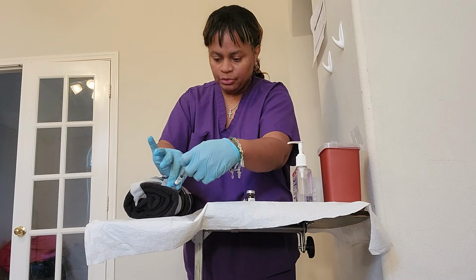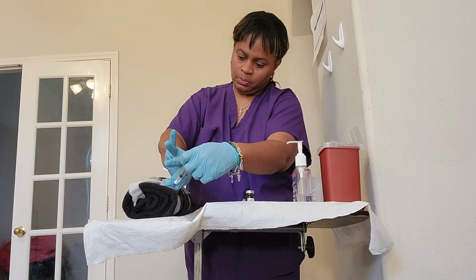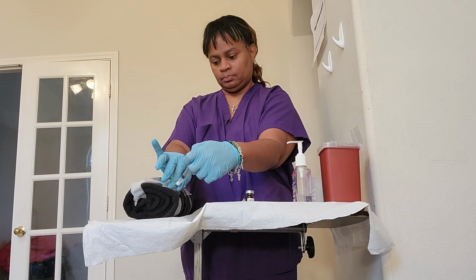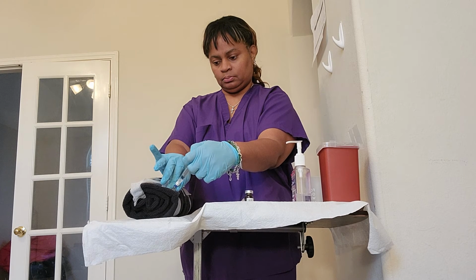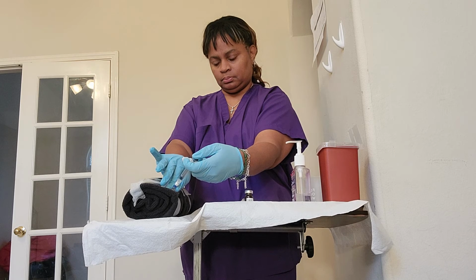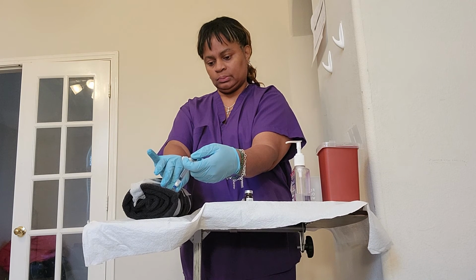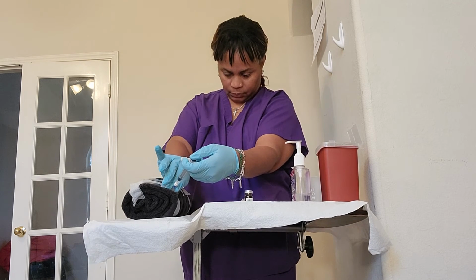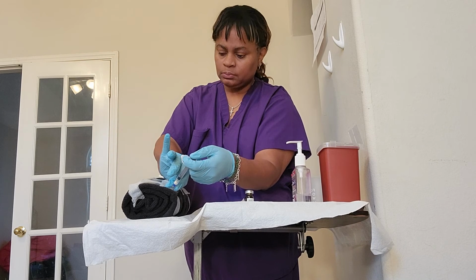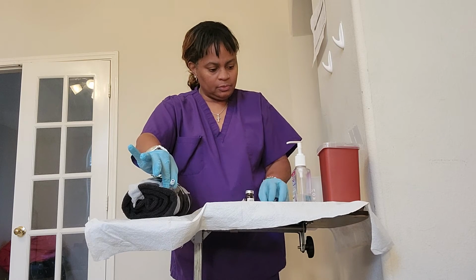We have 1 mL administered. And 2 mLs administered. Okay, so then we'll get 1 more alcohol pad here.